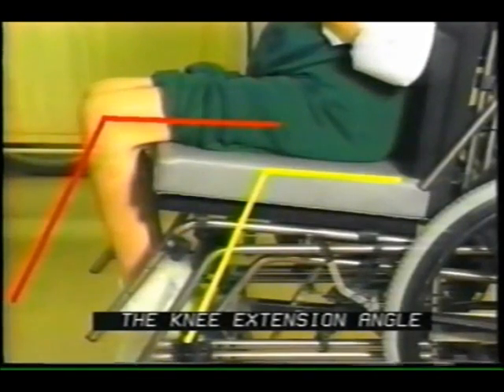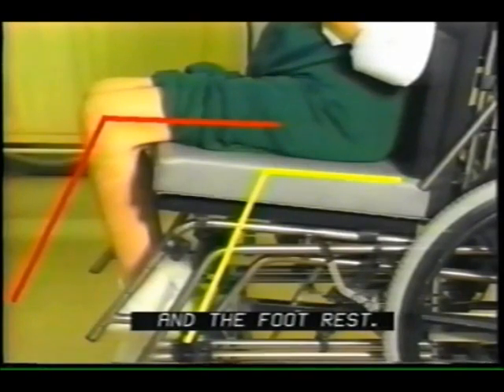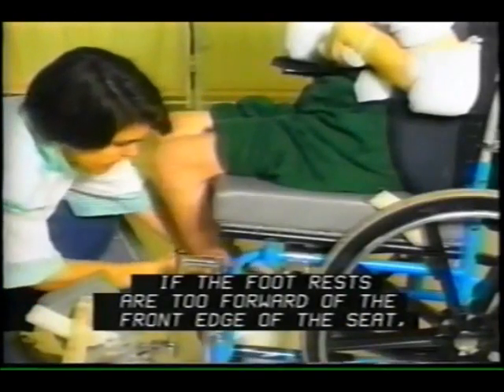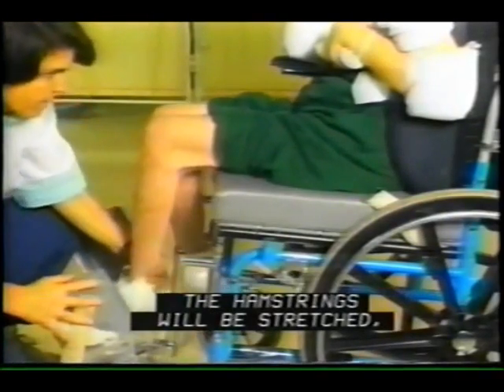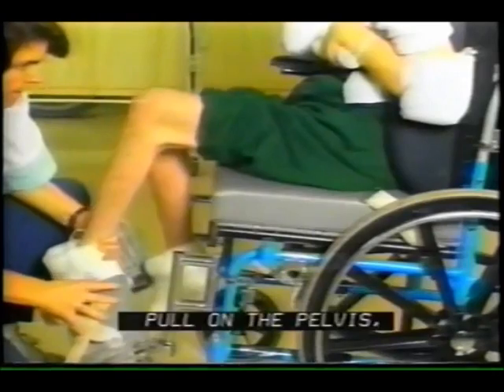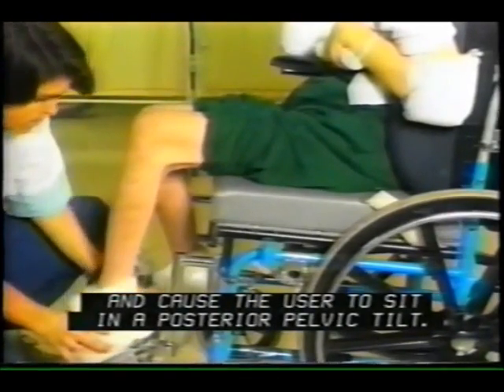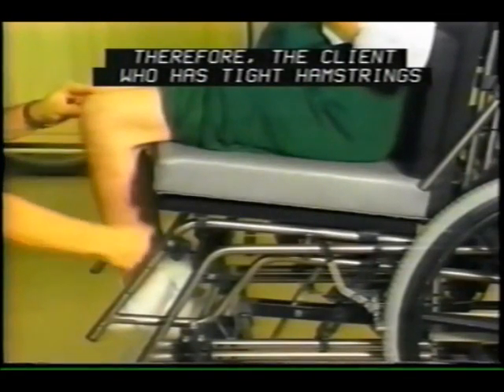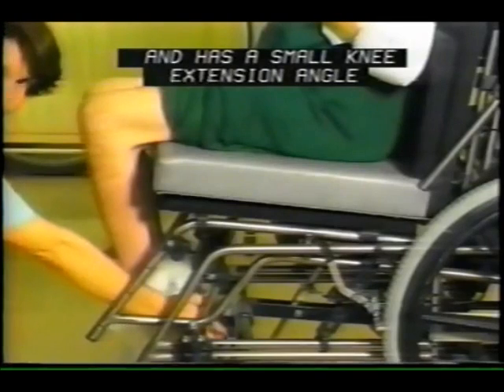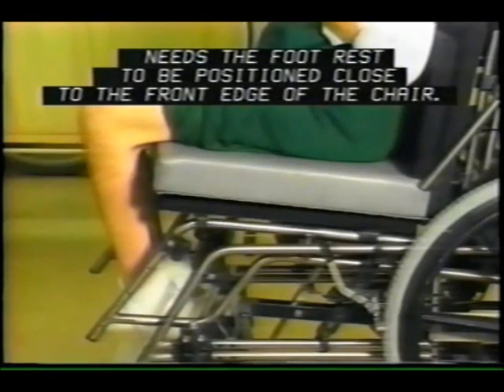The knee extension angle relates to the angle between the seat surface and the footrest. If the footrests are too forward of the front edge of the seat, the hamstrings will be stretched, pull on the pelvis, and cause the user to sit in a posterior pelvic tilt. Therefore, the client who has tight hamstrings and has a small knee extension angle needs the footrest to be positioned close to the front edge of the chair.